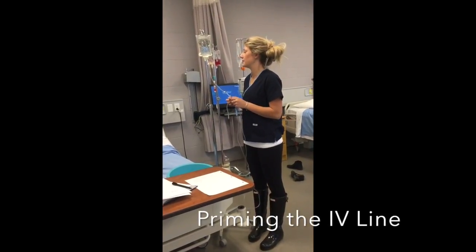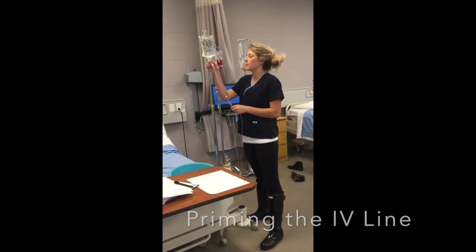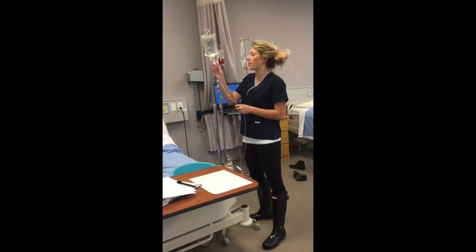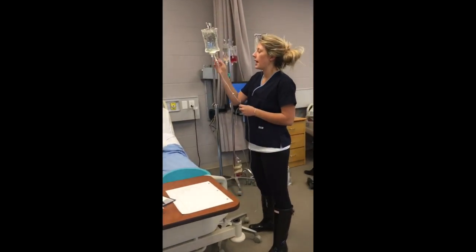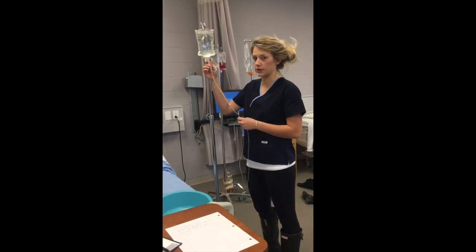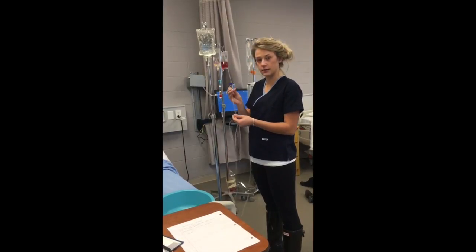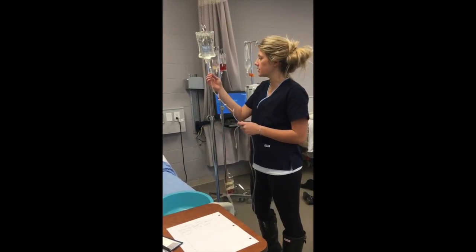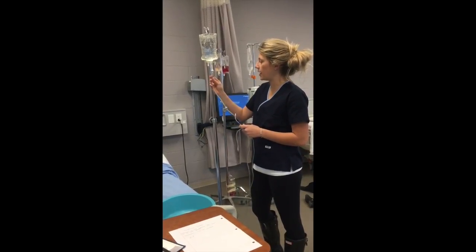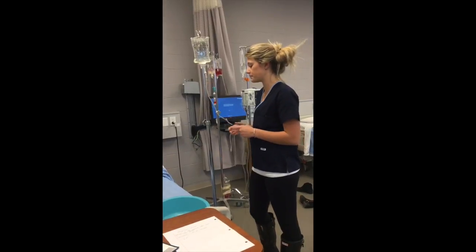So this IV line has already been primed, but I'm going to demonstrate how you would prime it. So you would start by pulling the plug out of the IV bag full of our solution and the top off the catheter tubing. And then you would insert the tip of the catheter tubing into the IV bag where you pulled the plug from. Next, you'd make sure everything is closed off, which it is. It's at the bottom. And then you would squeeze the drip chamber to make sure that it's dripping, and you would ensure that it is filled at the drip rate line in the drip chamber.